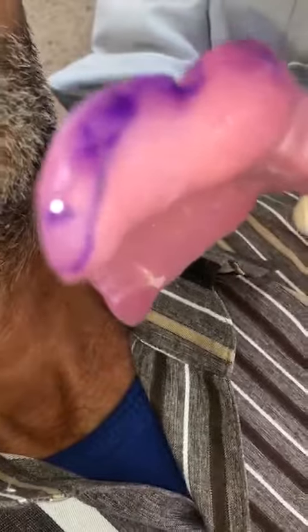So when you trim it, the question was how to trim it — it's not an actual v-shape. If you have two prominent fiber attachments, you could make two v-shapes. But if you don't have them and you have multiple fibers you cannot confine simply, you just make a wide v-shape opposite to them. This is how you trim around the buccal frenum.